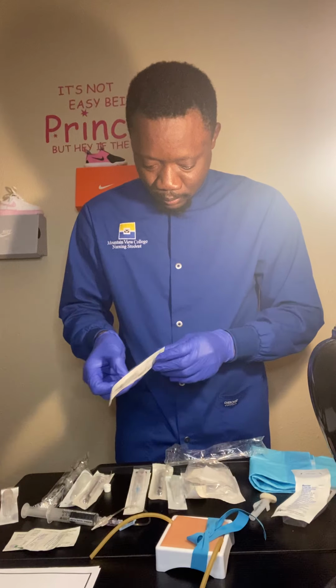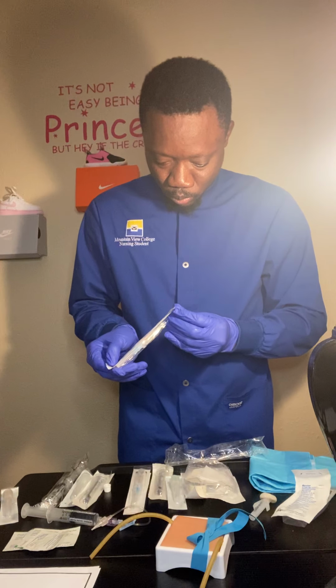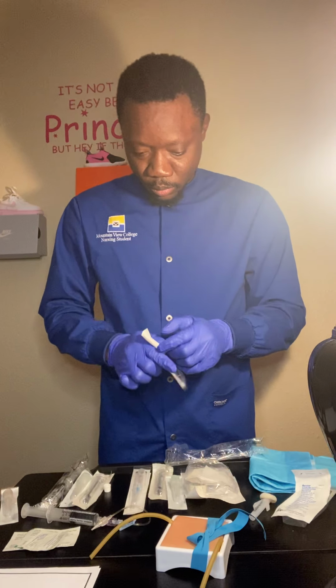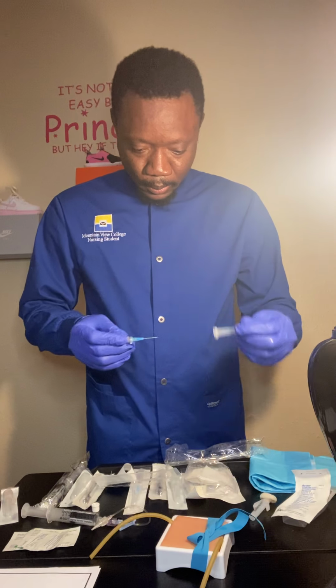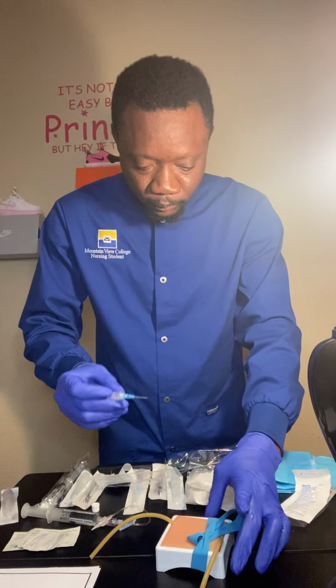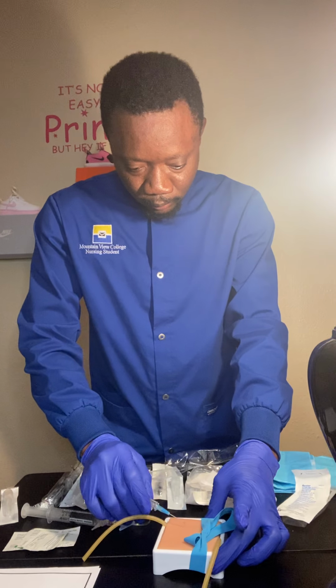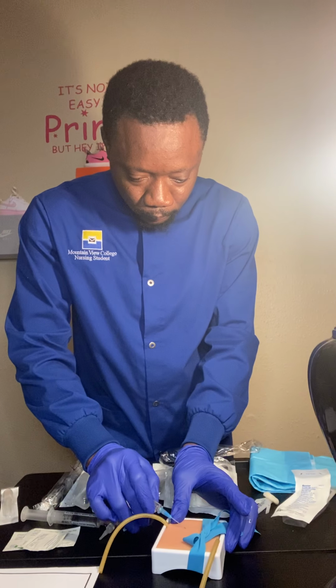I get my IV. Okay. The bevel up, at 15 degrees. I go ahead and hold it down. Let's stick.